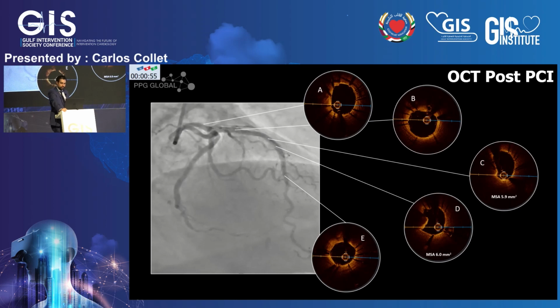What's a little bit more concerning is cross-section D. Cross-section D is a protruding calcific nodule, okay? Now you'll notice that the nodule is already starting to protrude through the struts. Once this happens, you have a 20% 2-year target vessel failure rate. Because as the artery continues to move, the nodule continues to push in and impinge, and the mechanism of failure here is reprotrusion into the lumen.